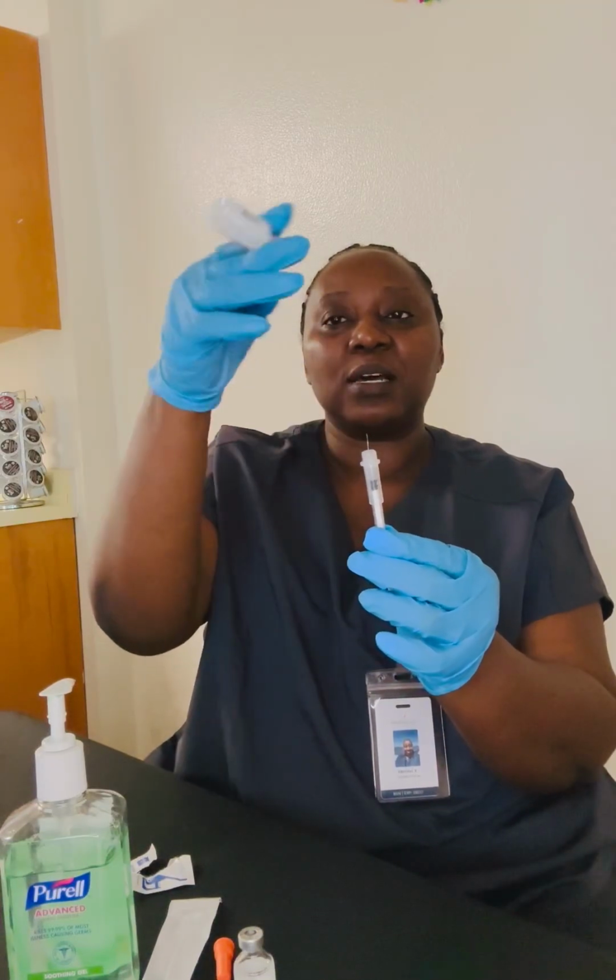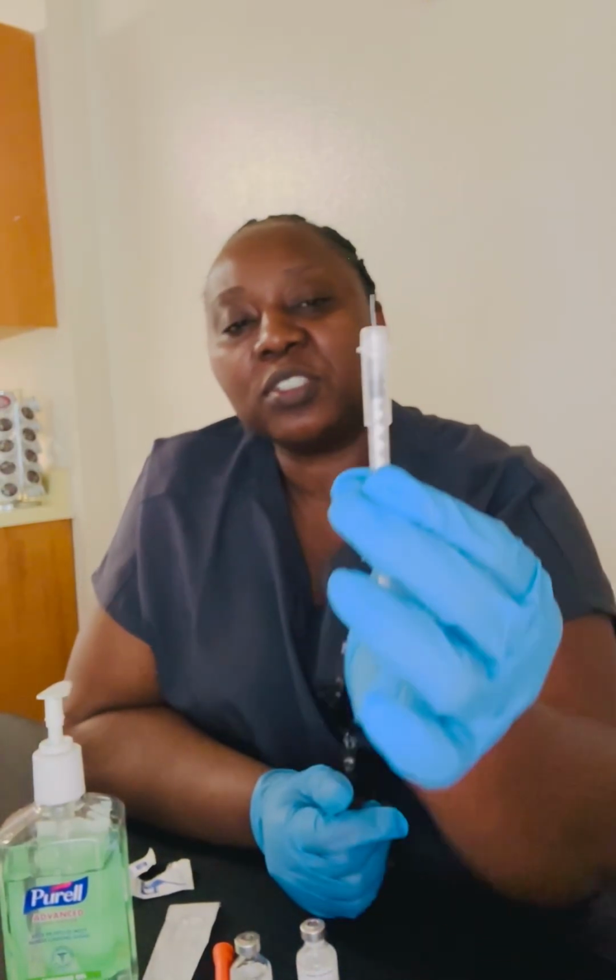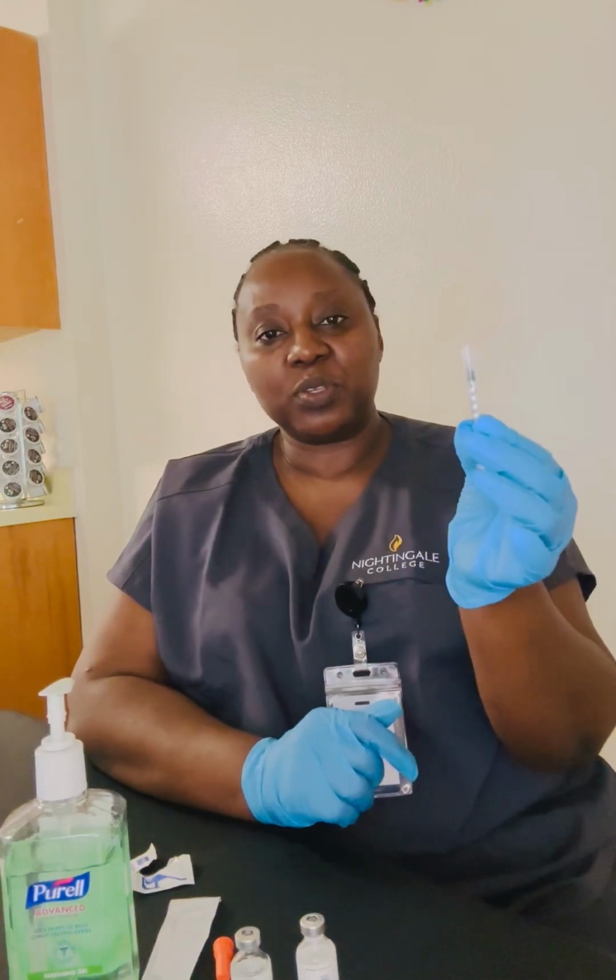Gently take out the vial, place down. Have the second nurse verify that. In total, I have 12 units. That is 4 units regular, 8 units of NPH intermediate, to have a total of 12 units.